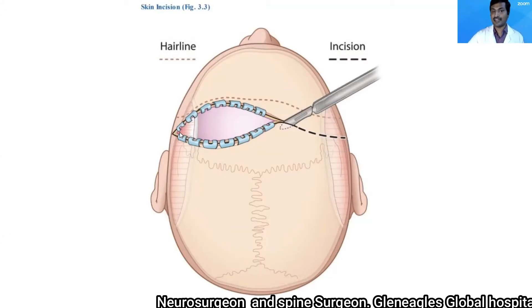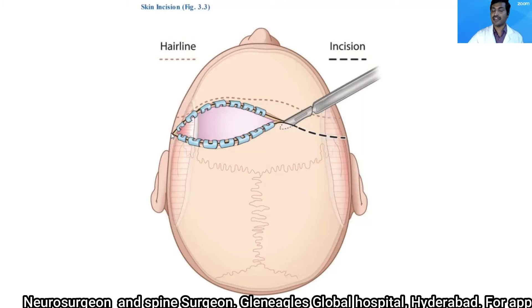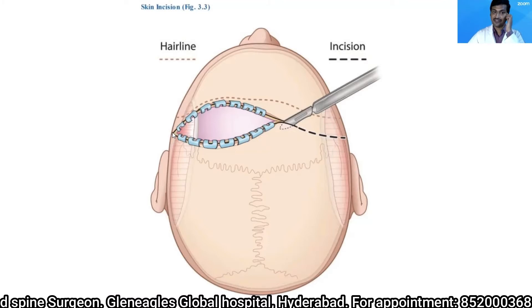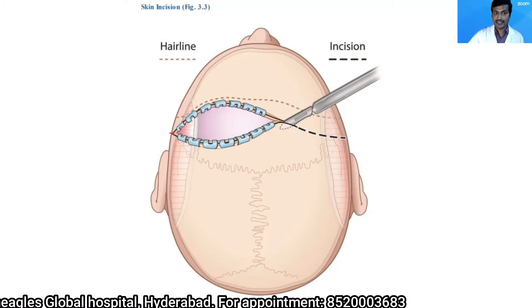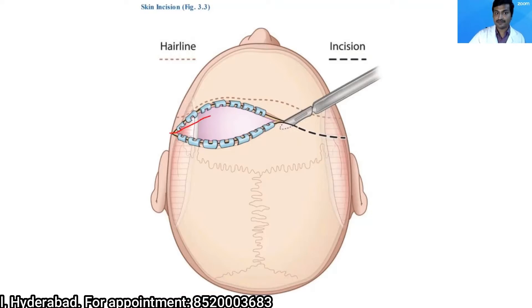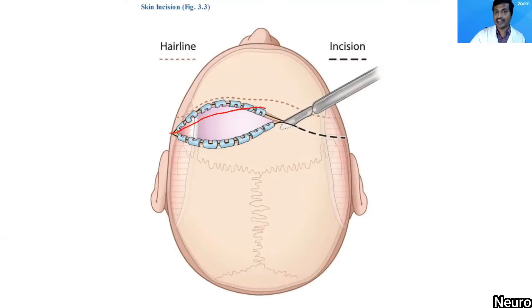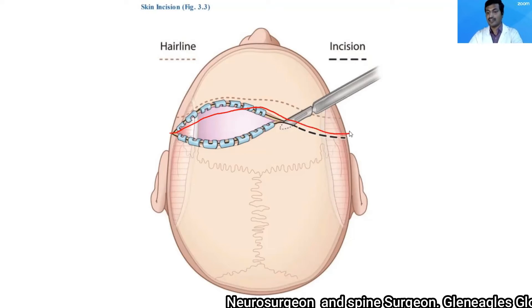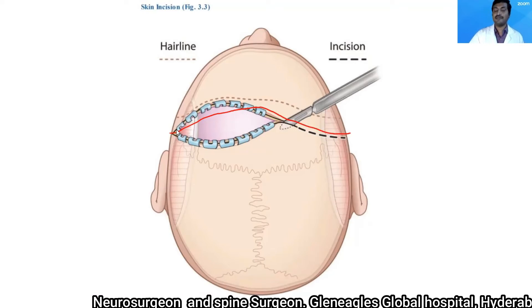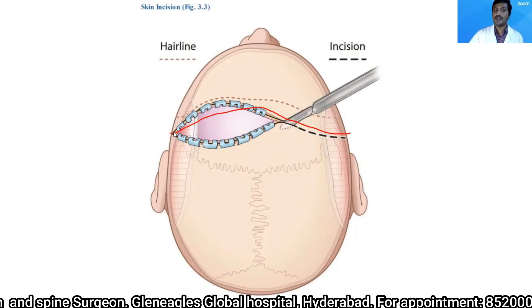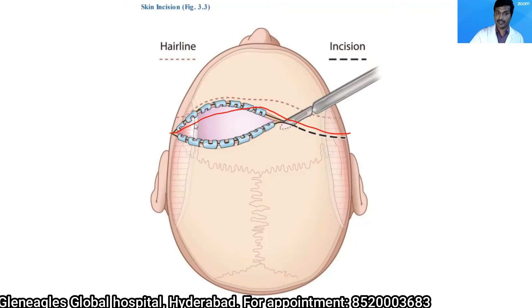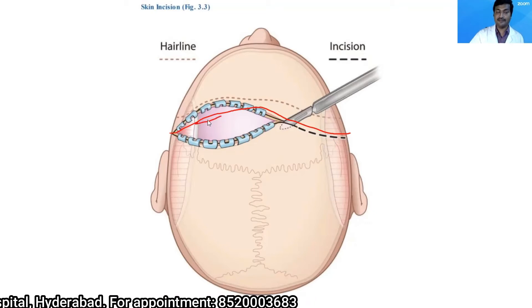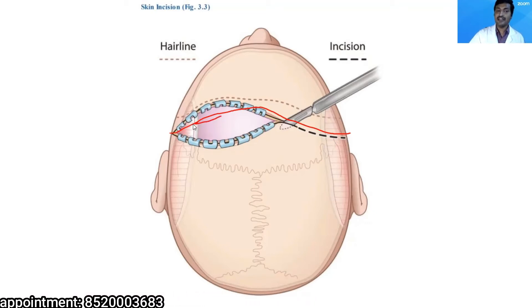We make a bicoronal skin incision starting from the zygomatic arch on one side, at least one centimeter in front of the tragus, running along just behind the hairline to the midline, then mirroring to the opposite side. I use a number 15 blade to incise the skin down to the level of the pericranium above the superior temporal line, and down to the temporalis fascia below it.